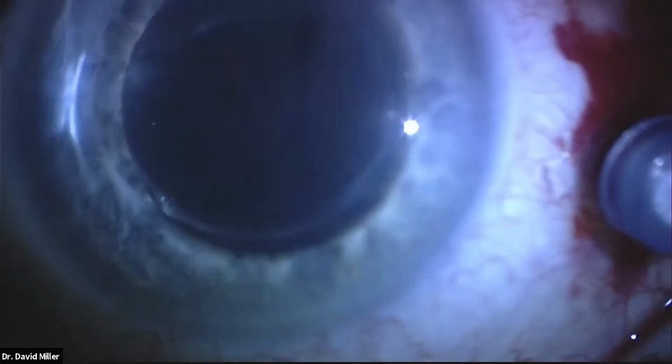I'm going to use C3F8 because the break's just above the horizontal. If it was up higher, maybe SF6, which is shorter acting. I'll use 15% C3F8 gas for this case. Pull the fluid out from over the optic nerve again first, and then go back to the retinotomy site. You can get the gas, Mike, we're good. So Mike and Julia are going to get the gas prepared.